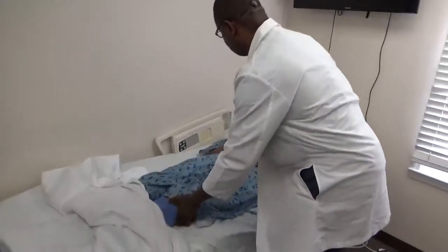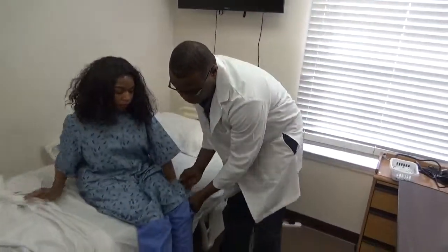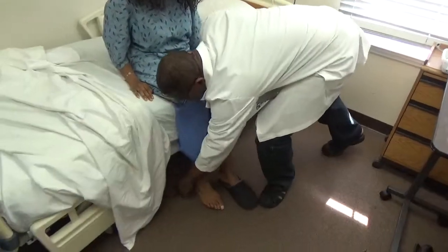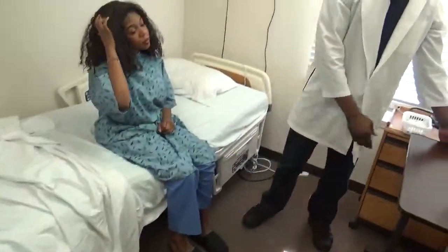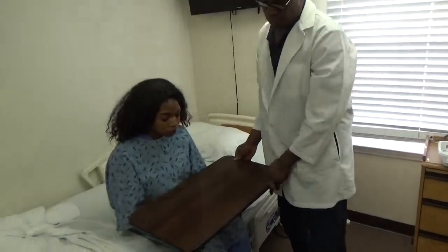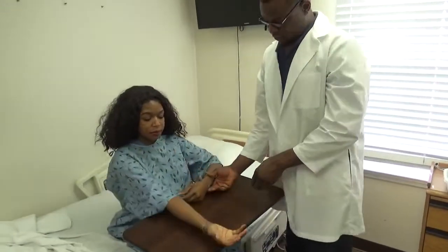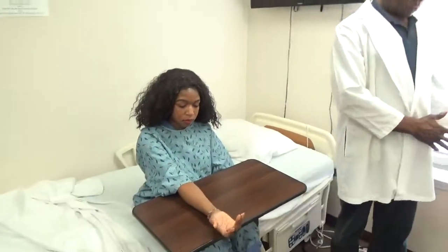I'm going to set you up, okay? You can assist the resident to sit, and put on their shoe. You will bring the bedside table to you. I need you to place your hand out like this for me, just one hand.